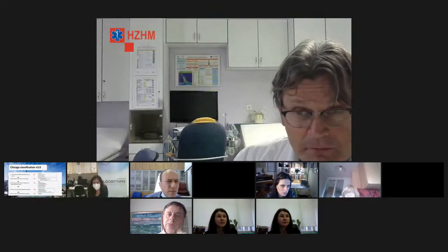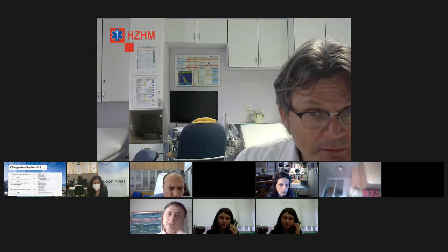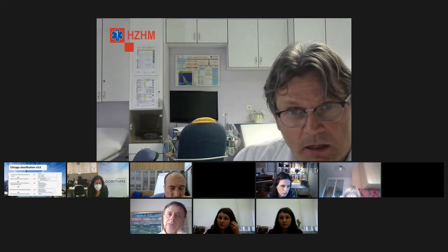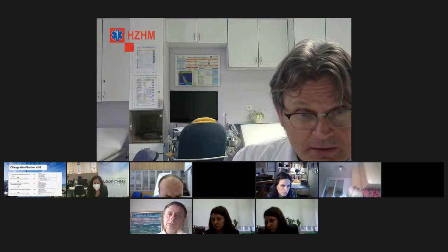High resolution manometrija je možda najveći doprinos u dijagnosticiranju ahalazije, posebno tipa 3.